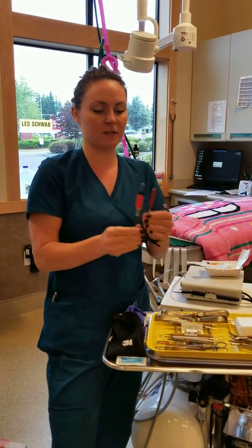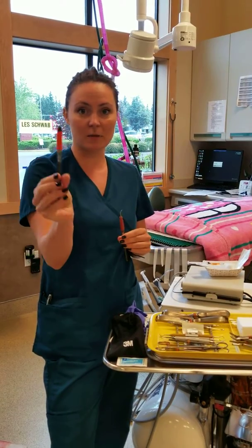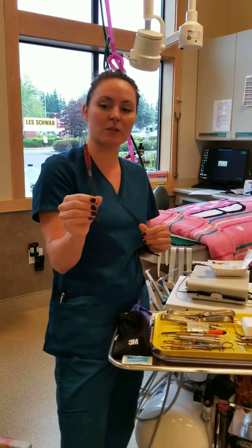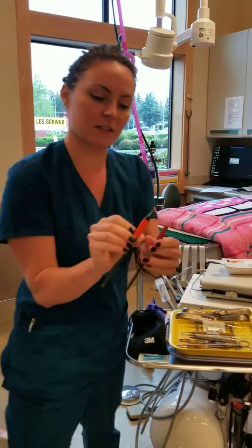Then we have two different scaler heads for our ultrasonic scaler. This is a subgingival scaler head, so this one stays underneath the gum line. And this is supragingival, so this one stays above the gum line. The tips of them look different, you can tell.